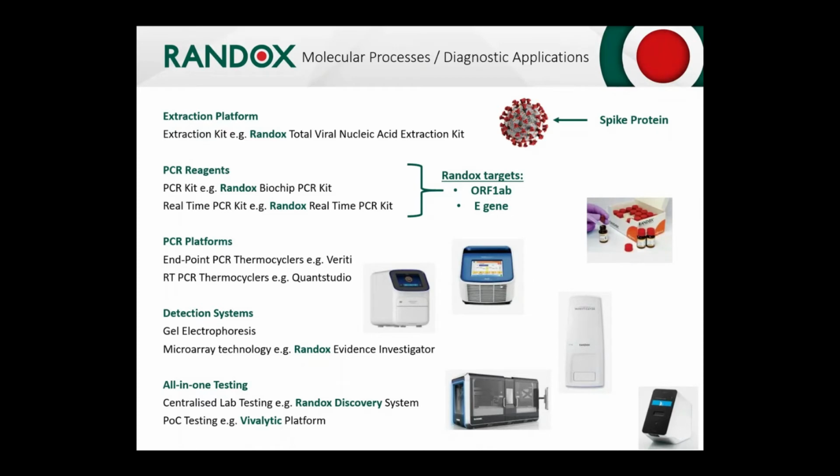Yeah, well, again, COVID has really brought these all-in-one systems to the fore. Over the course of the last 10 months, you'll have systems that are based for centralized laboratories, not specifically molecular, but general clinical chemistry, immunoassay, serology labs that don't require that traditional molecular workflow. Because the beauty of these all-in-one systems is that everything happens in a concealed environment. So you've got your point of care systems about the size of a coffee machine, and then you have these larger systems that are much more capable of multiple results at the same time.